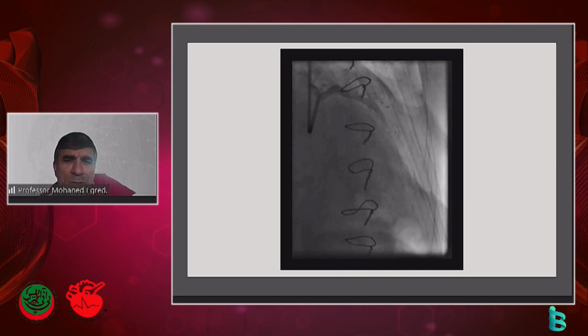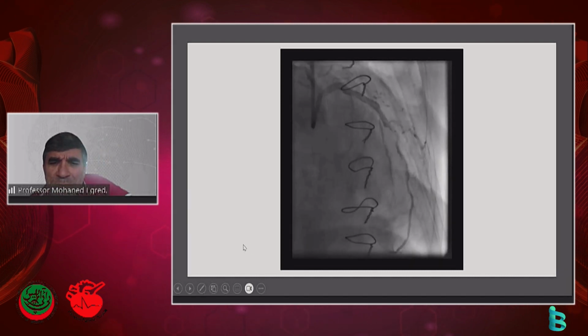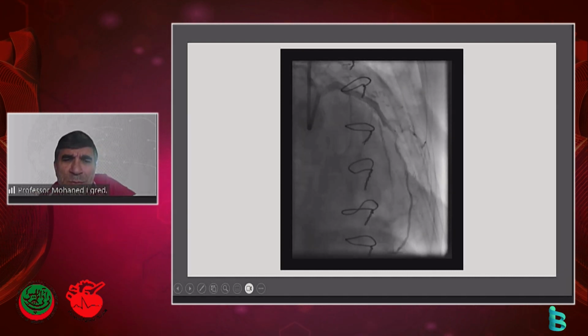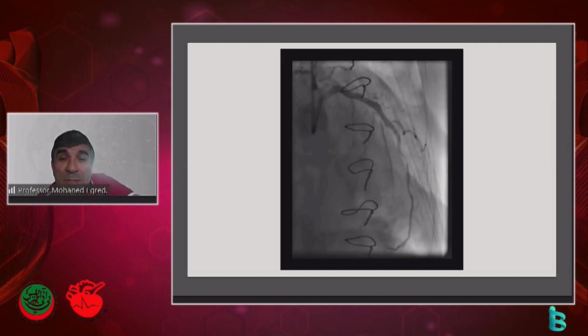And that was, let me just, we ended up stenting the artery, and this was the final outcome. The lady was able to go home, and she was not admitted again to hospital, and did very well.